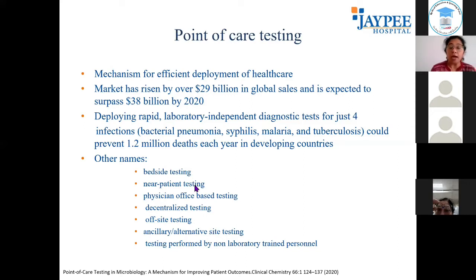Yeah, so this is where we work, and the different point of care testings have been given different names. You have tests which are done bedside, near the patient in the ER. There are some point of care tests which are done at the physician's office. Say you have a sore throat, you go to the physician's office. There are a lot of tests, though not used much in India, which can be done for Streptococcus pyogenes, and you get a diagnosis at the physician's office.